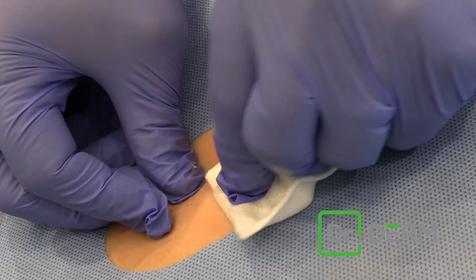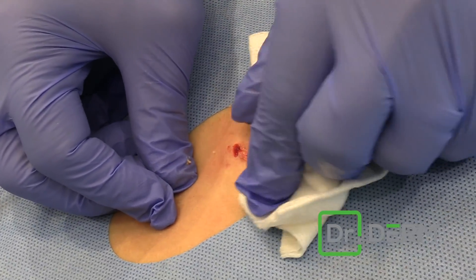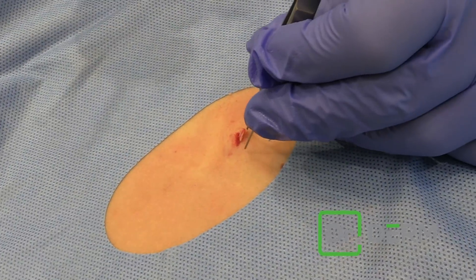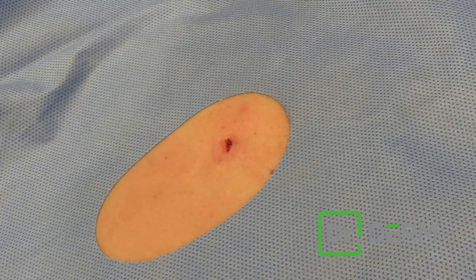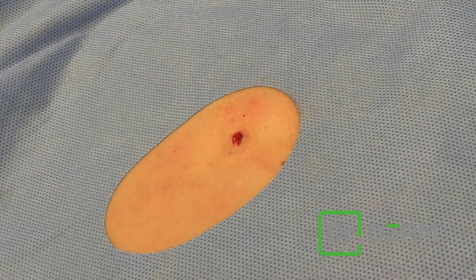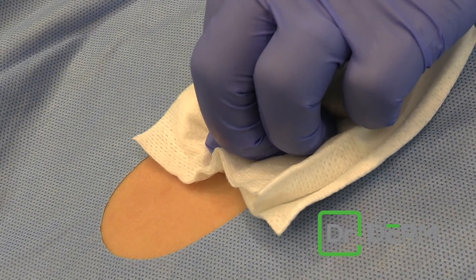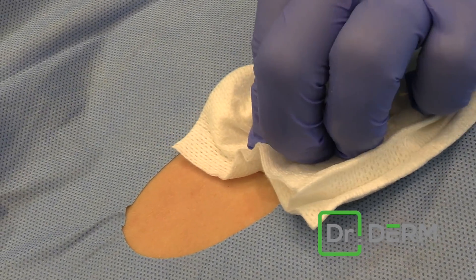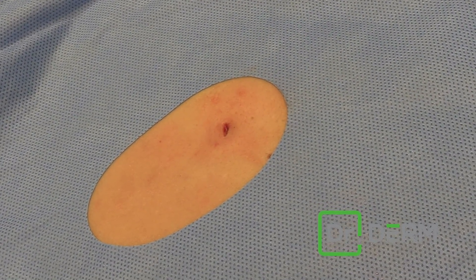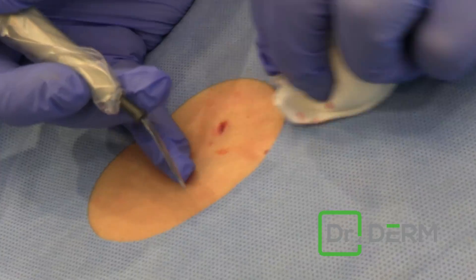So this is always when you just have this little tiny area. We can take that off there. It's such a small spot — should we put a stitch in there? You know, you can get infection, and really it's going to heal about the same. So here's where I like to use just a tiny bit of heat just to keep the cyst from coming back.